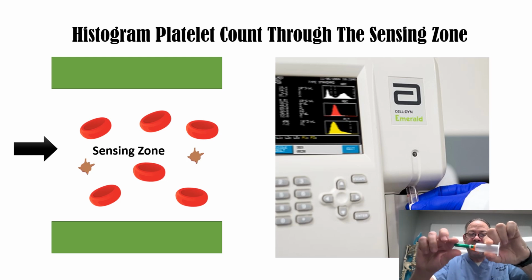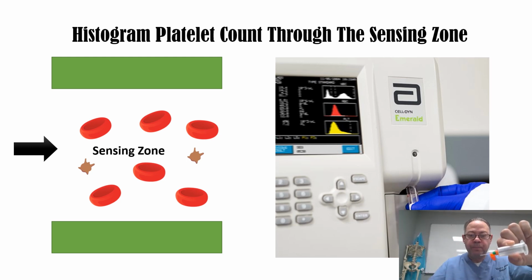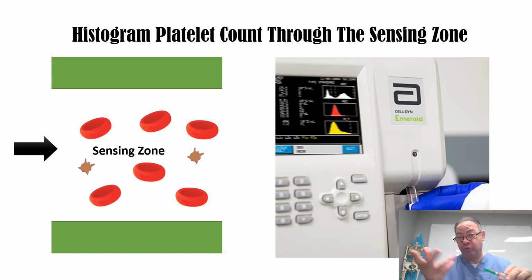This is the proper needle that we use exactly to draw blood for venipuncture. You never recap, I'm just doing this to practice, okay?